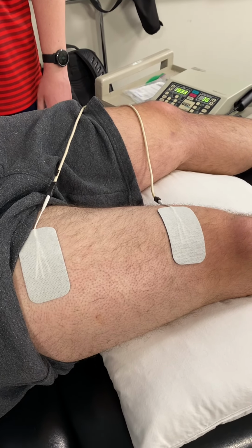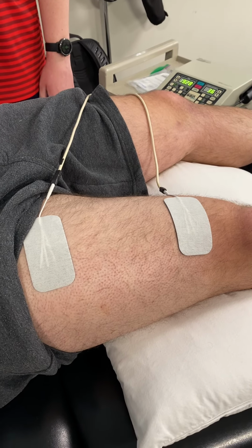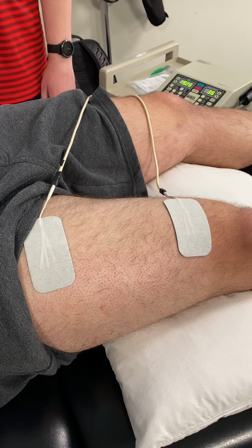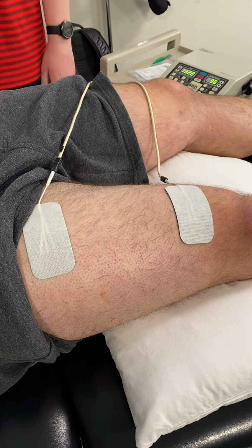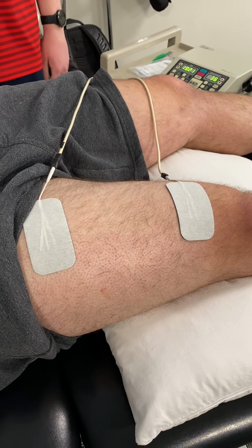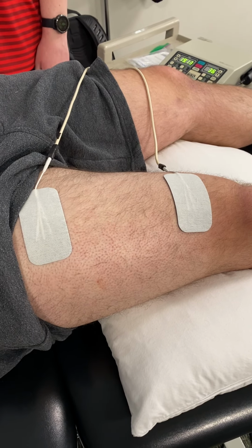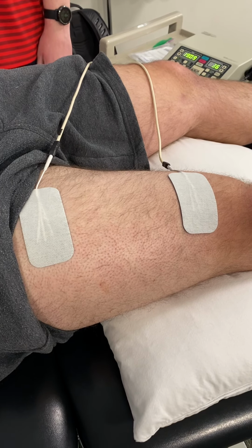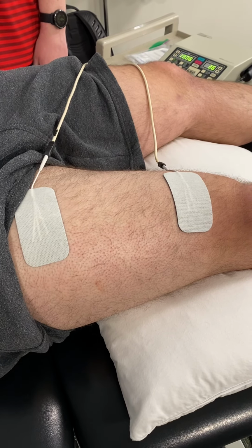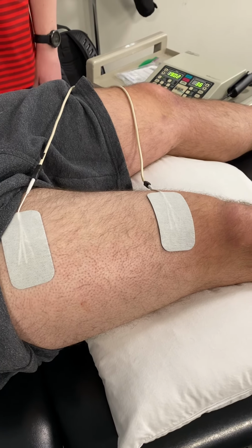He's having issues contracting or getting his quad muscle to contract. So we're going to be using biphasic pulsed current electrical stimulation to re-educate this muscle and strengthen the quadricep muscle. The nerve that will be activated is the femoral nerve. And some contraindications with electrical stimulation are pregnancy, having a pacemaker, active cancer, cognition, and sensation.